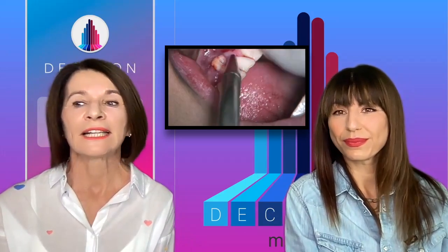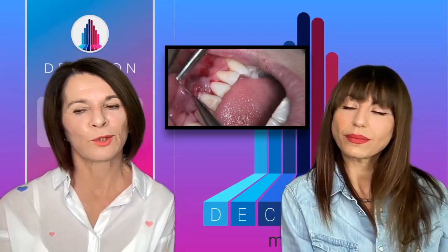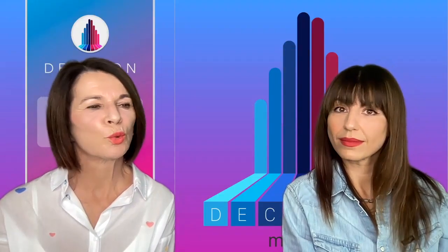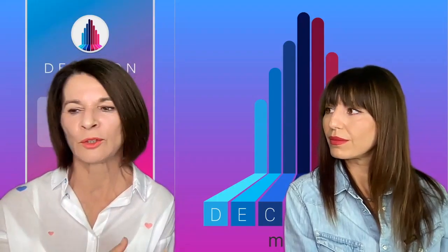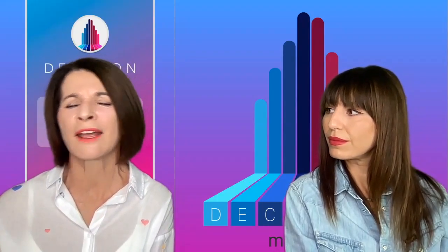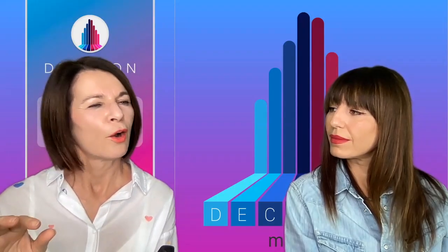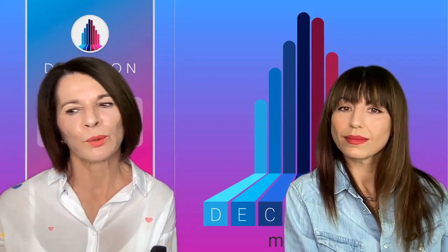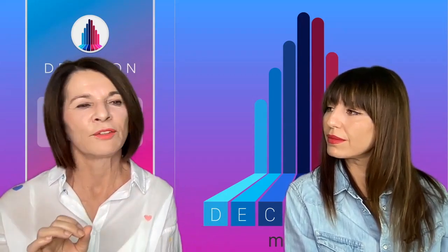It may be a risk, so one should always choose the tooth with the biggest sulcus to be able to introduce the connective tissue graft. One has to handle the tissue very gently. It's always good to combine tension with the sutures, like in the lasso technique, and very gentle pushing, utilizing the tweezers. This is what helps.